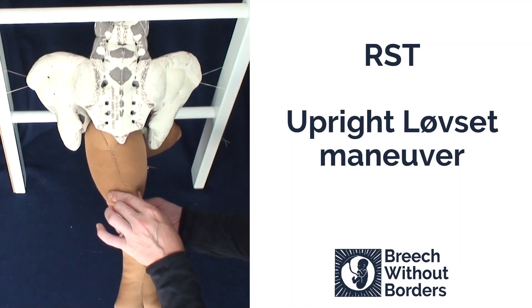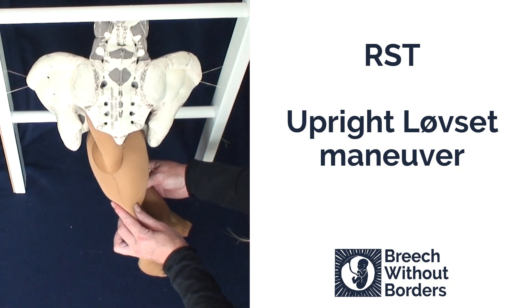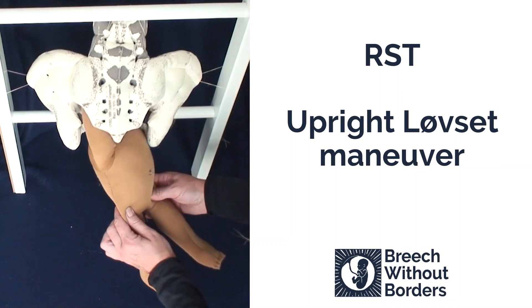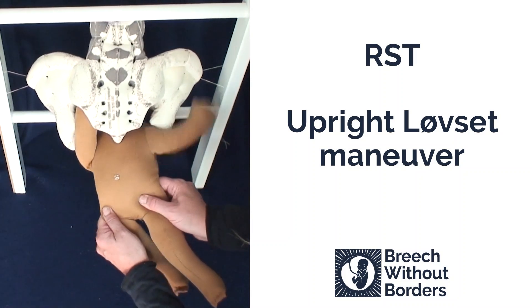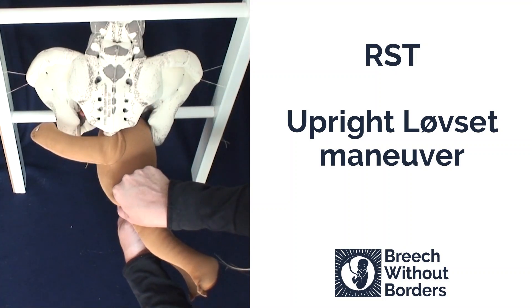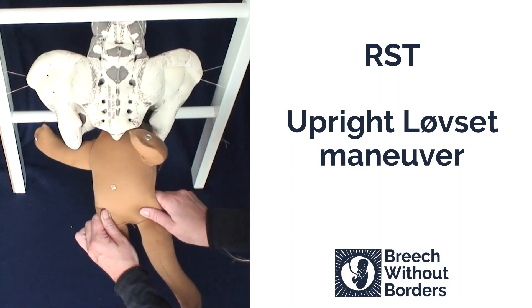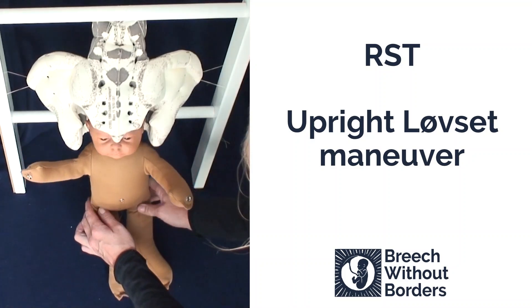Next, repeat the same actions. Flex the baby laterally, following the direction of the sacral curve, to bring the next arm low down into the sacral area. Rotate 180 degrees, again going through sacrum anterior to the other side. This will release the second arm under the pubic arch. To finish, you might need to rotate 90 degrees back to sacrum anterior, and then deliver the head.